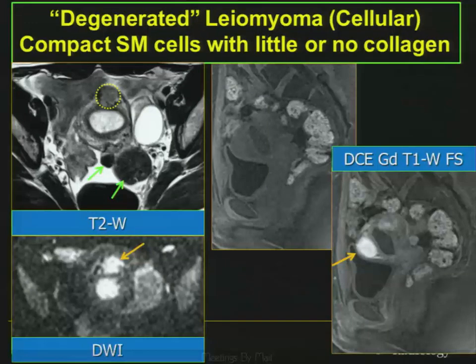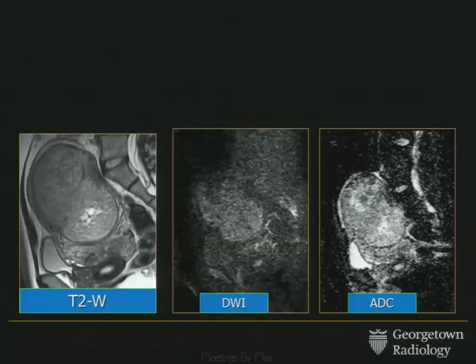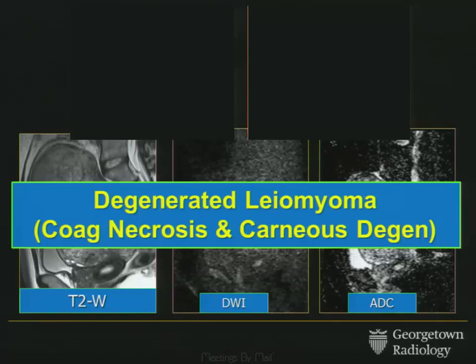But what about this case — one of the ones I showed in the test at the beginning? Lobulated, irregular — it almost looks like it's going through the myometrium. There are no obvious blood products on T1 fat-suppressed. Following contrast, some enhances and some is necrotic — a mixed bag. On the diffusion-weighted image and ADC map, there's not classic restricted diffusion. Sitting at the PACS station, is this a good fibroid or a bad fibroid? We were worried — we didn't think she should go to uterine artery embolization. This turned out to be a degenerated fibroid with coagulative necrosis and carneous degeneration, with no sarcomatous elements. She didn't get to preserve her uterus, but we were worried enough that this might be a sarcoma.